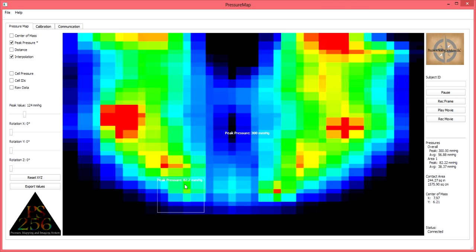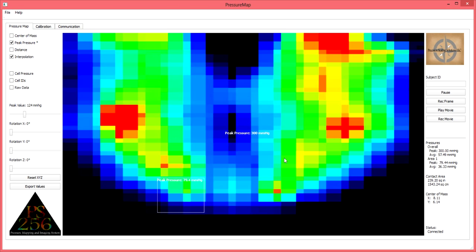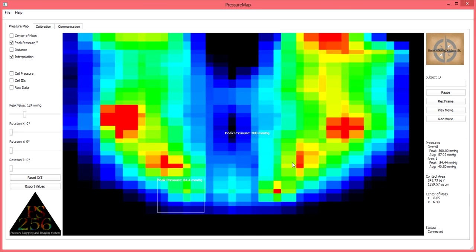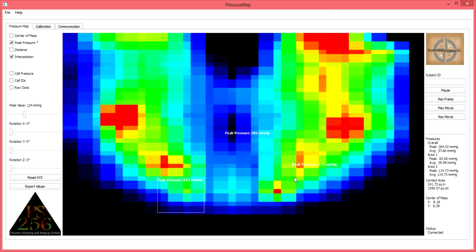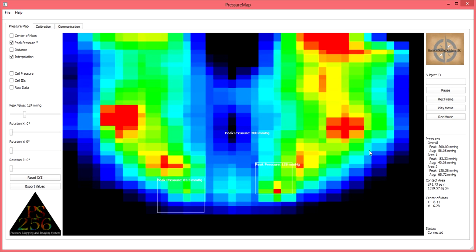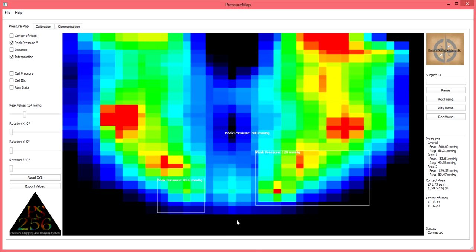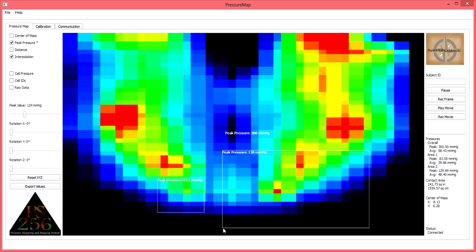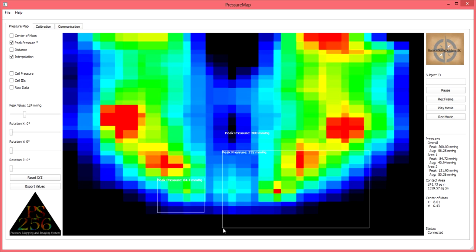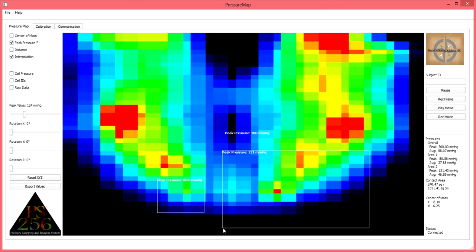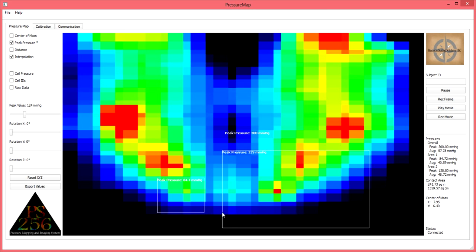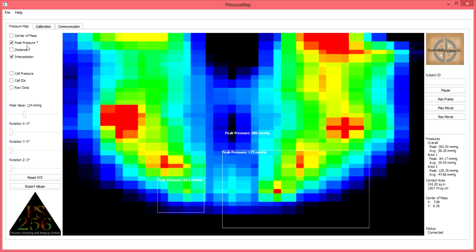To place a second peak pressure box, use the same technique with the right mouse button and an additional peak pressure box will be placed again displaying the peak pressure identified within that box.